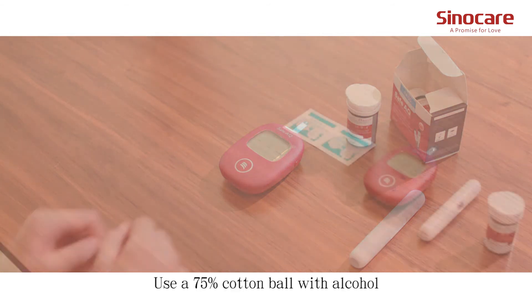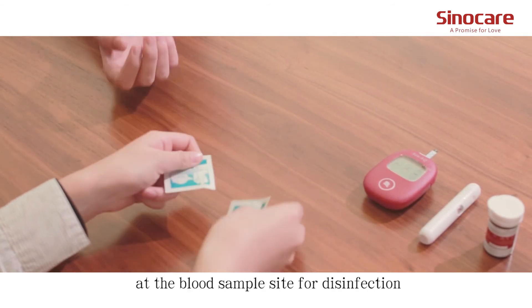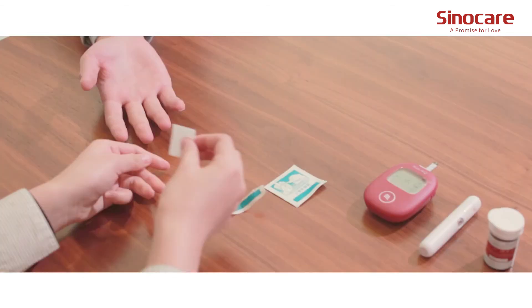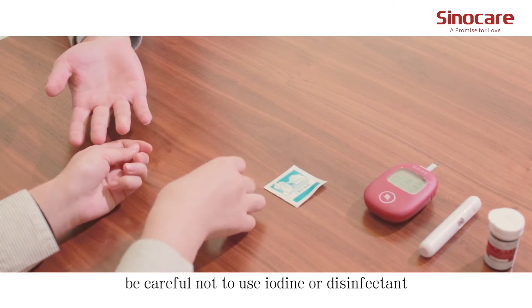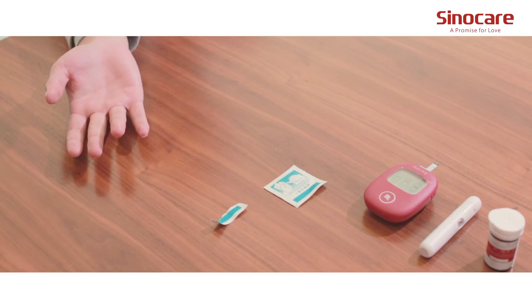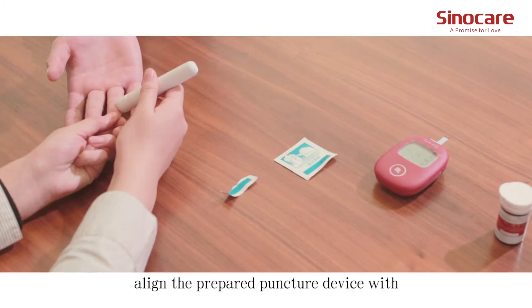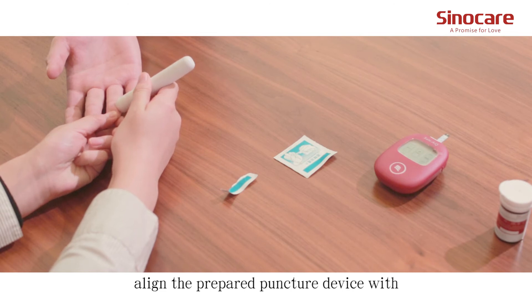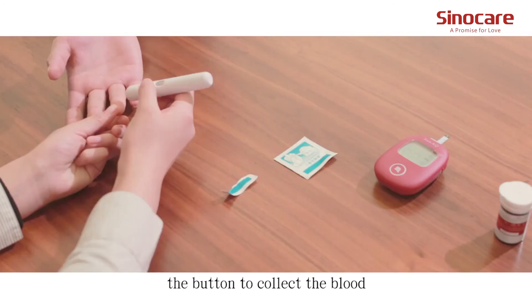Use a 75% alcohol cotton ball at the blood sample site for disinfection. Be careful not to use iodine or any disinfectant containing iodine. Once the alcohol has evaporated, align the prepared lancing device with the disinfected skin and press the button to collect the blood.